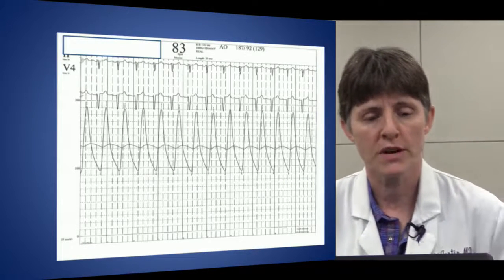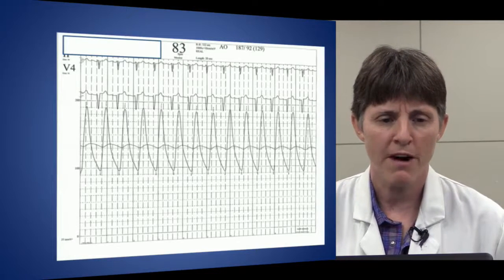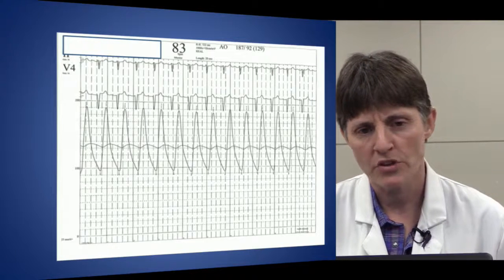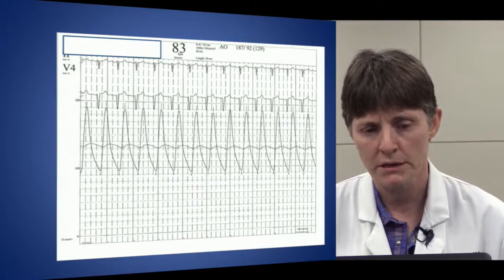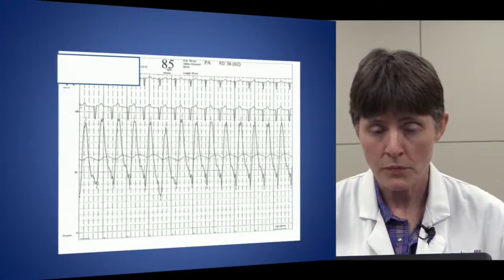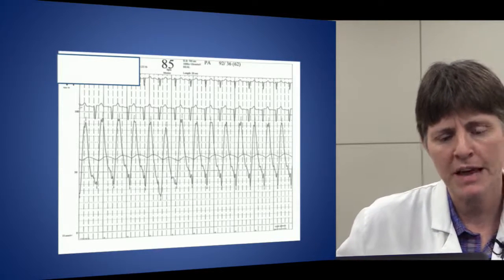This is an aortic tracing again. So rapid upstroke following the QRS complex and then comes down. And so this pressure would be 190 over just under 100 with a mean of 130 or 135 or so. A PA tracing, again, very high, but the same exact shape.